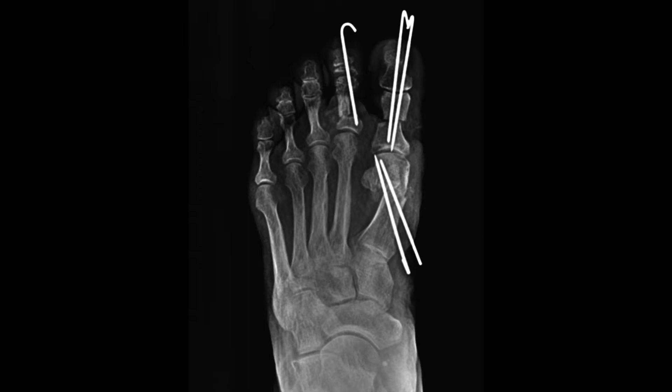You can see where we made a straight cut in her foot for the hallux and rotated it out into the correct position. Her second toe was overlapping her big toe, so we performed an osteotomy here. The fixation method pushes the toe and straightens out the metatarsophalangeal joint area as well.